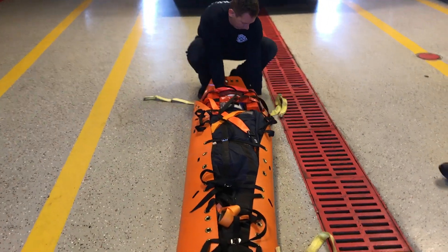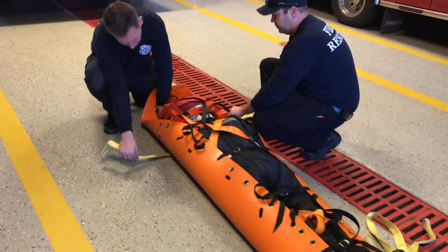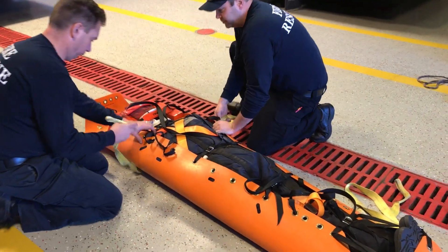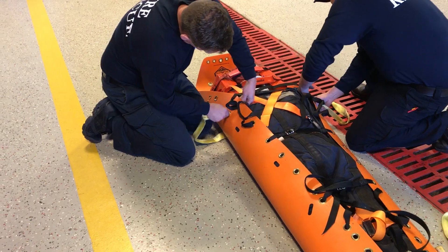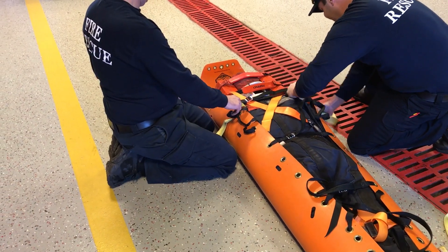Alright, so now we're going to rig the sked to do a horizontal raise or lower. There are two lifting straps that come with the sked. One is marked head strap — obviously that one goes at the head. It is shorter than the other one, and that helps keep the victim in more of a head-up position.